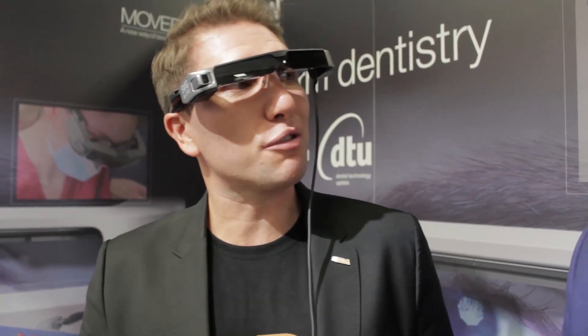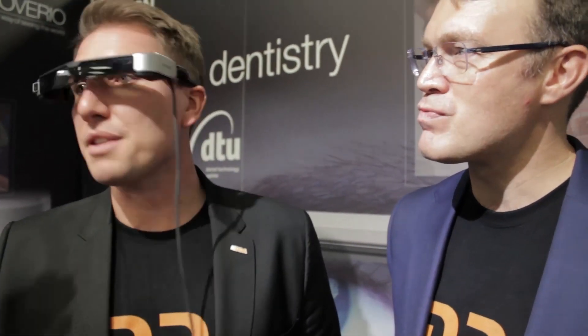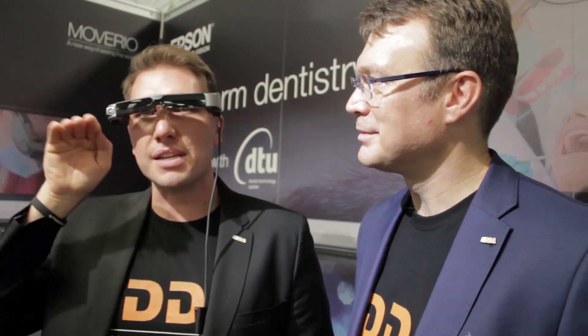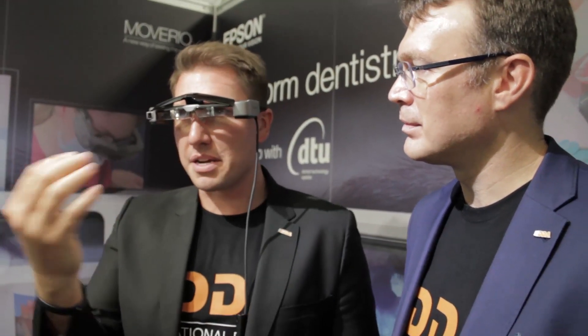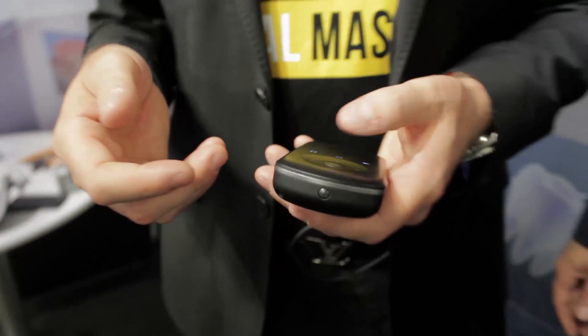The guy who recommended this — Martin — thank you. He recommended these and when we came over to the stand, I think a lot of people would see these and think you're going to see maybe a little picture, or something see-through. But when I'm looking at this, I can flick the screen up and I can see out — and it's still exactly the same, not see-through. I can see everything very clearly in focus and control the menu easily just by touching icons. Talking to the patient indirectly without verbal communication is definitely something very good. It also fits over glasses without smudging them.